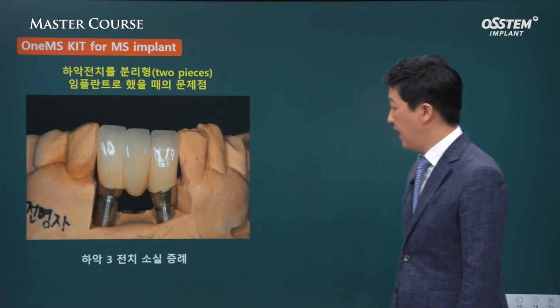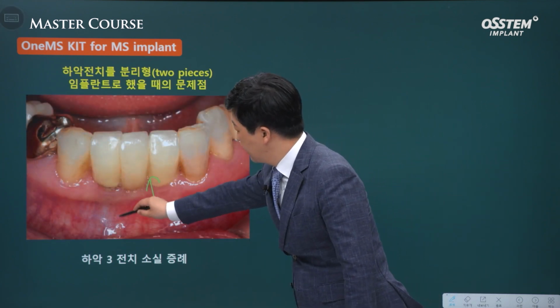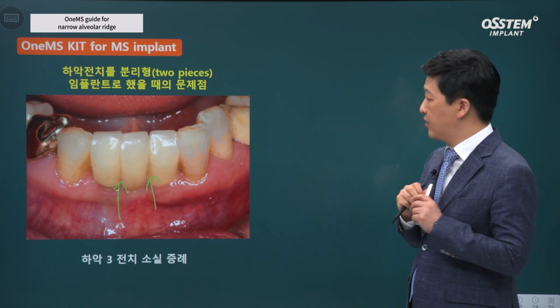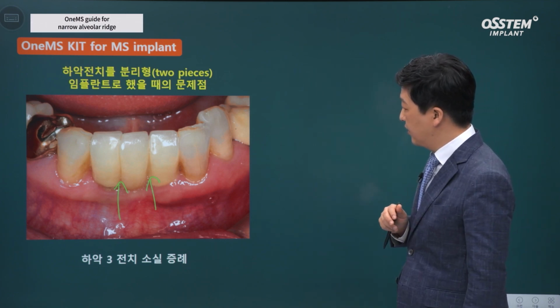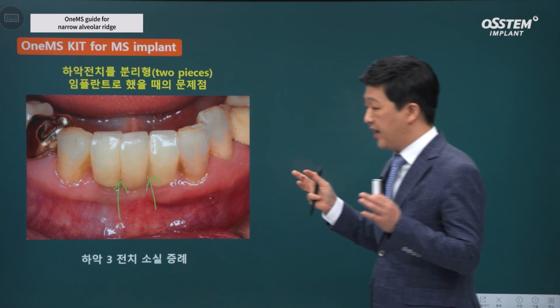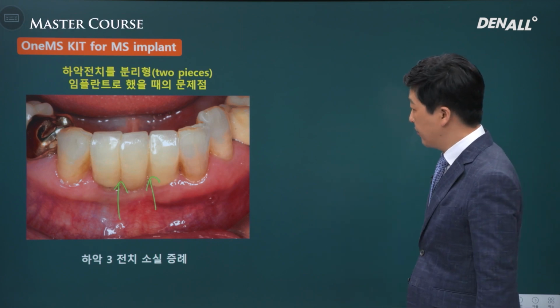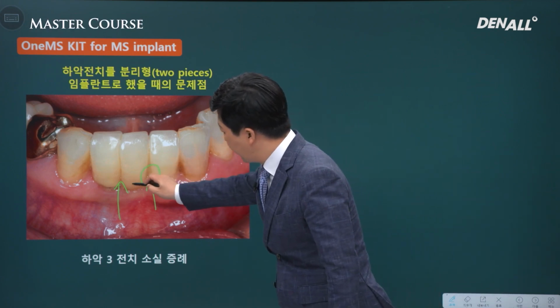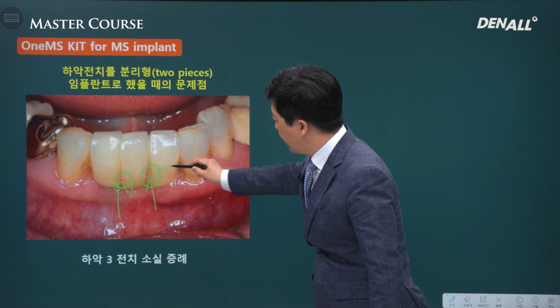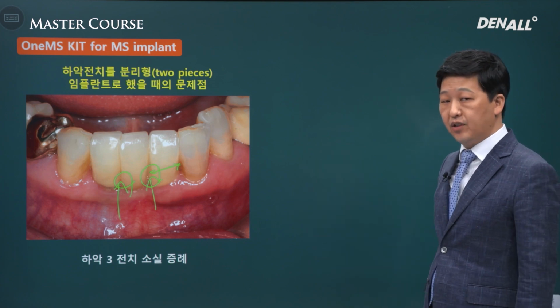As you can see, this area, the embrasure area is very tight. It's blocked, and in certain cases, it's very difficult to provide appropriate crown and pontic size. This looks very congested and it's not easy to adjust the width. In terms of maintenance, there can be many problems.